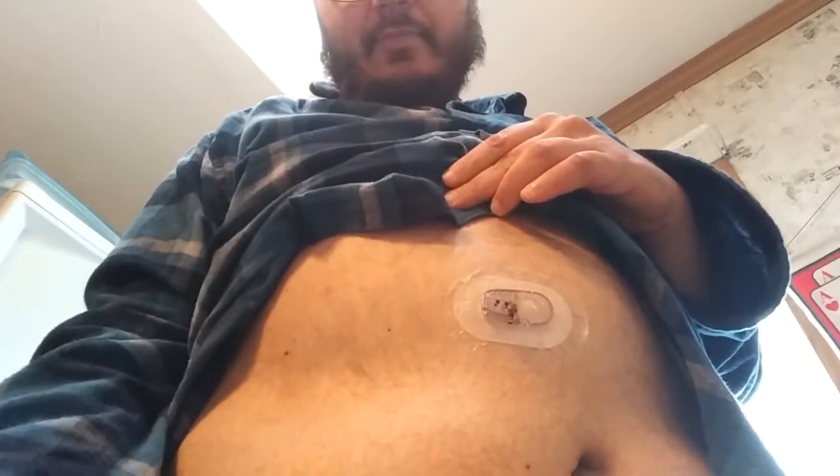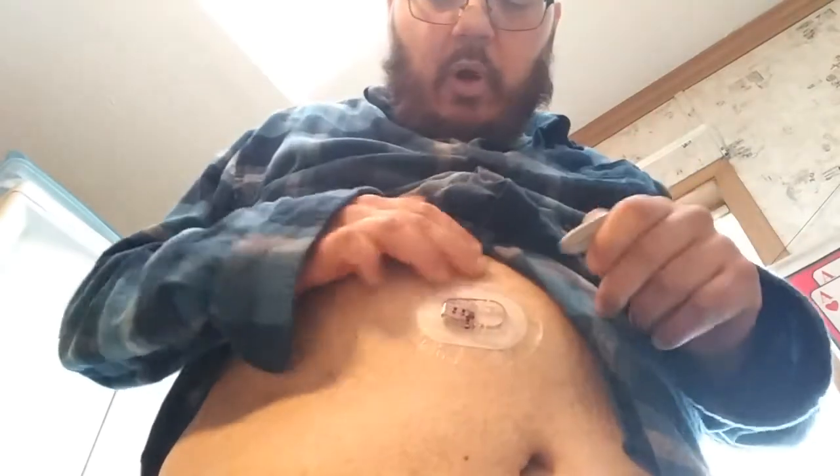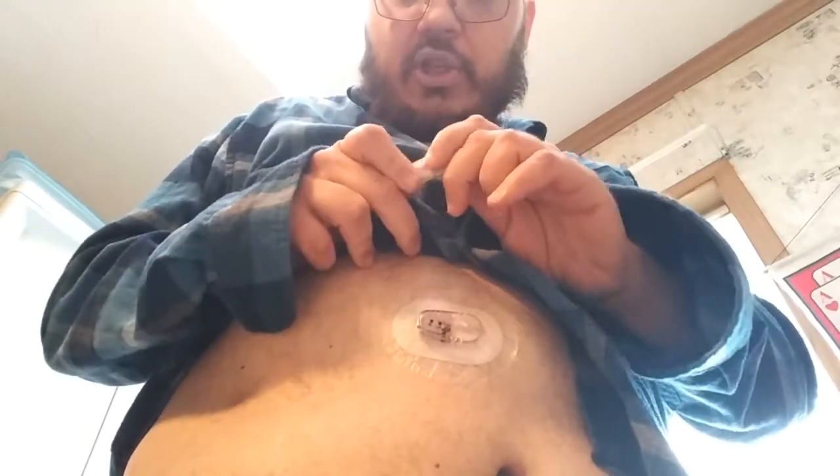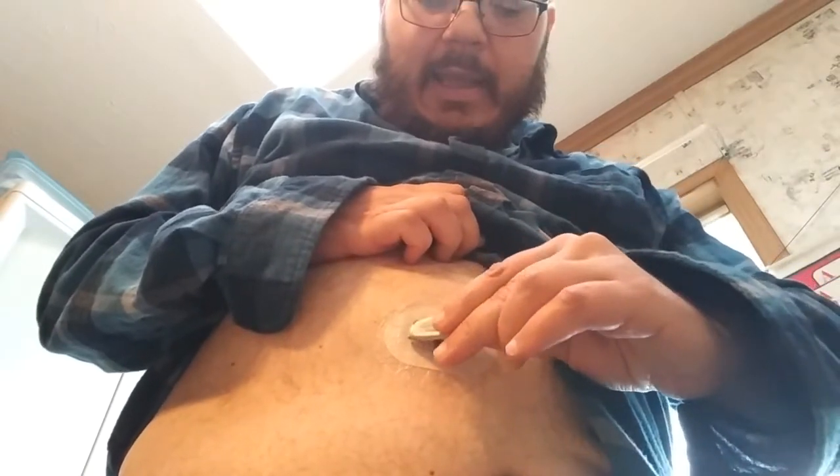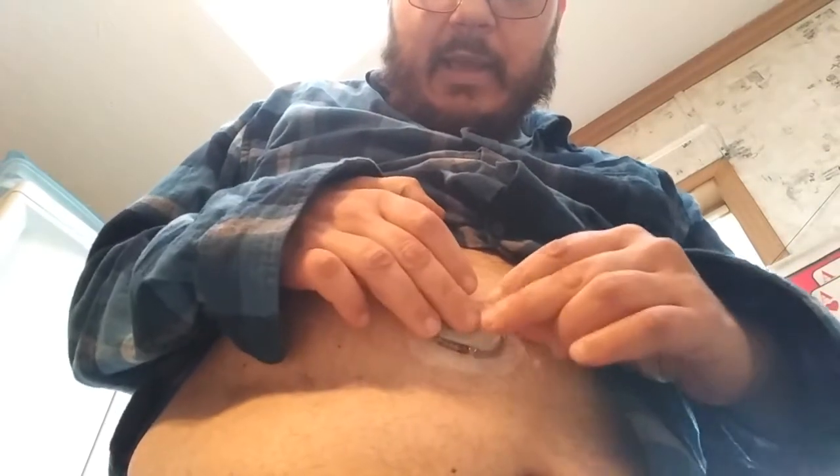We'll take our transmitter and put it into the sensor housing. You're going to put it in with the skinny end going in first, down through this way, and then you're going to hear a click. Once you hear that click, it's secured in place.